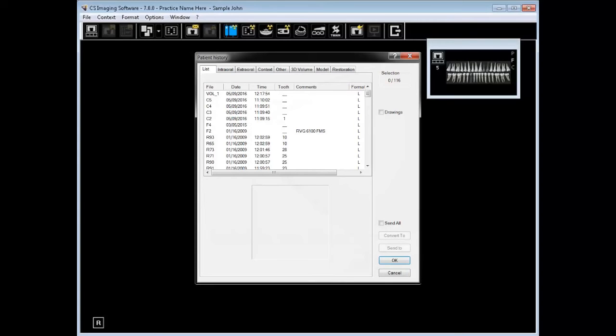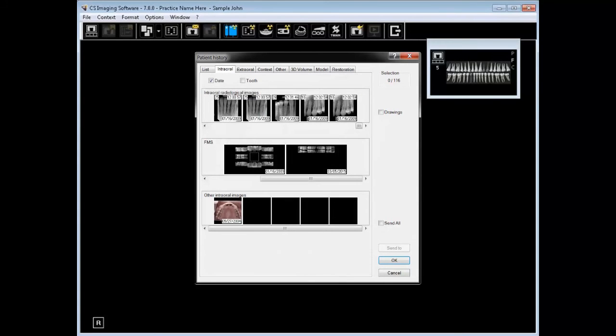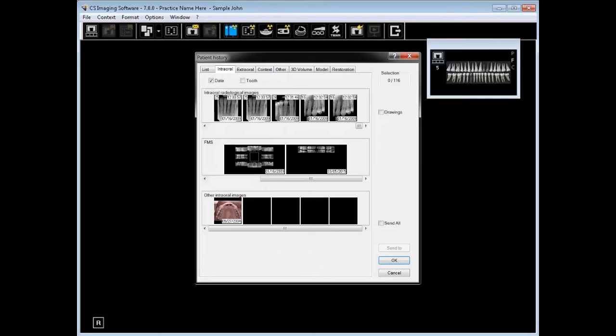The next tab of the patient history, intraoral, you would click to see a list of all the digital intraoral radiographic images. You could also see images taken in a format or intraoral color images that might have been obtained from an intraoral camera or a digital camera. At the time the images were saved, they were classified as intraoral.